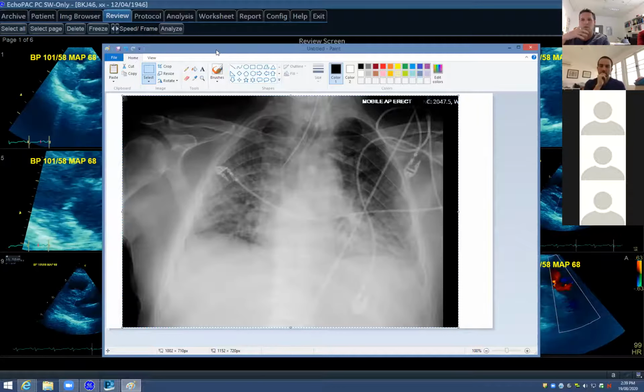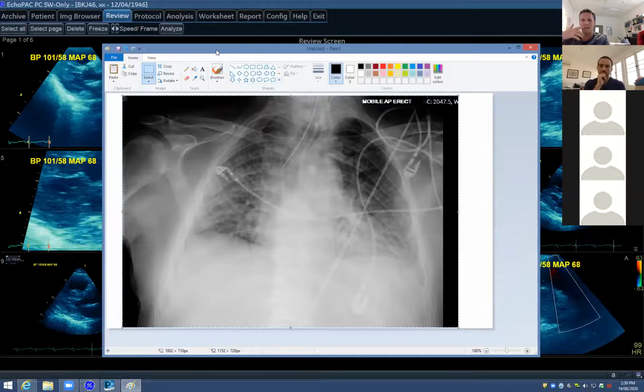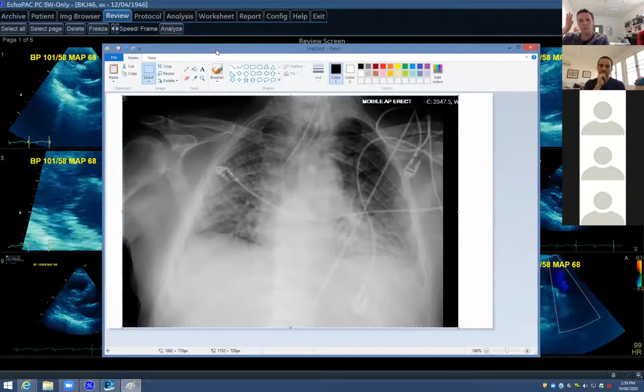So this guy starts to become more and more hypoxic, and he ends up getting intubated. If you've looked at that previous echo, obviously we're going to show you the next echo that we've done.